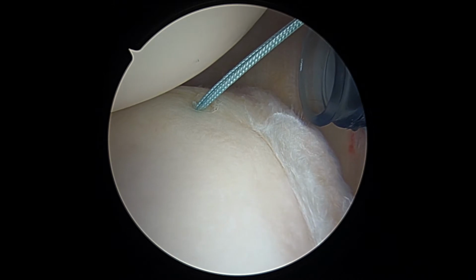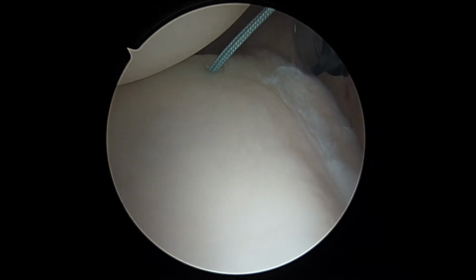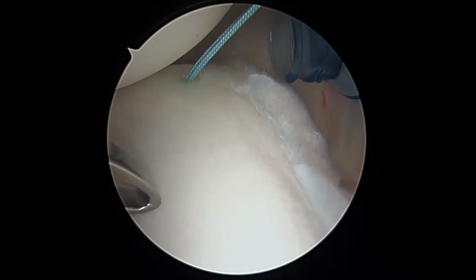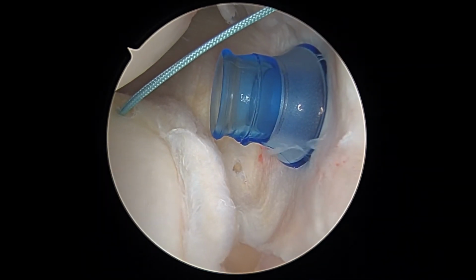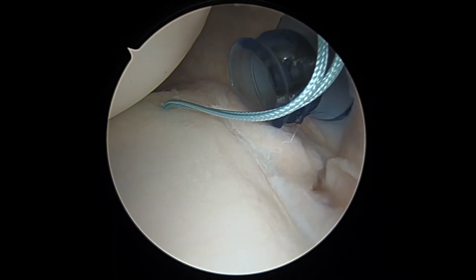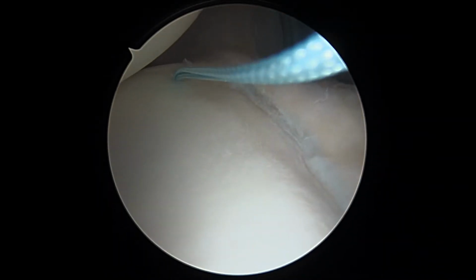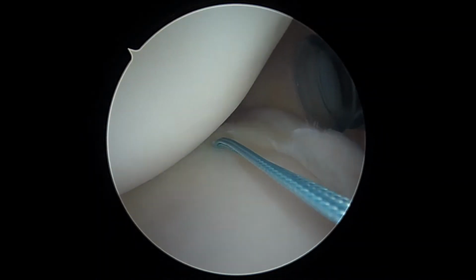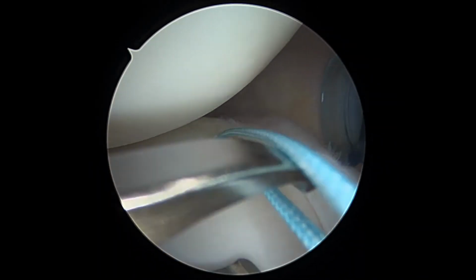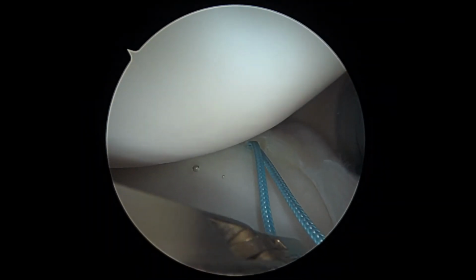And so now I'm going to take an instrument, got it, to bring one suture anteriorly anyway. Often here we'll need a second device to pass it to ourselves. And as I recall, we had to do that on your other side too. So maybe that probe you had, or I can even use this. So we're just going to move the sutures up here where I can get to them a little bit easier. Yeah, we're good. I got it. And so we'll reach in here now. And it almost doesn't matter which suture I take based on what I'm seeing here, but we'll take this one.